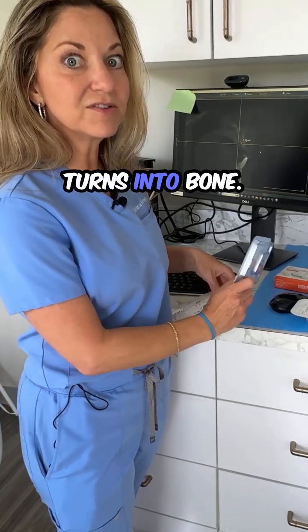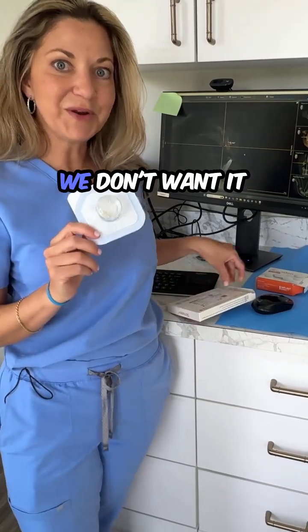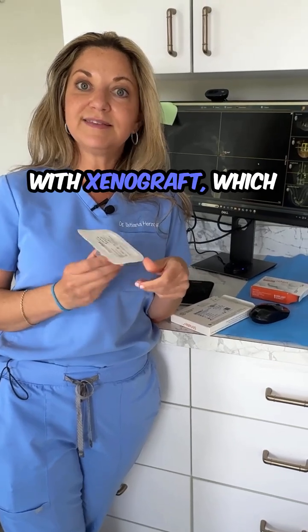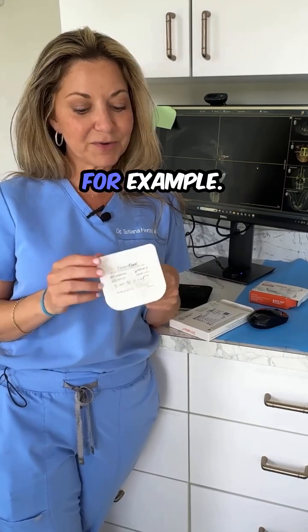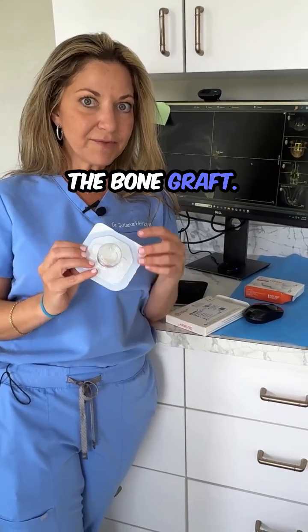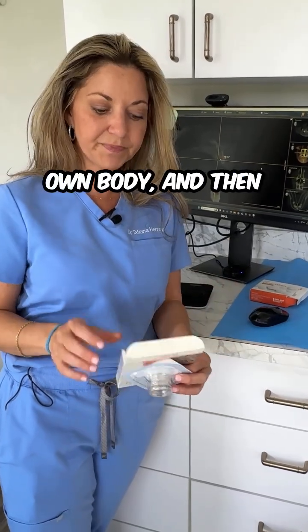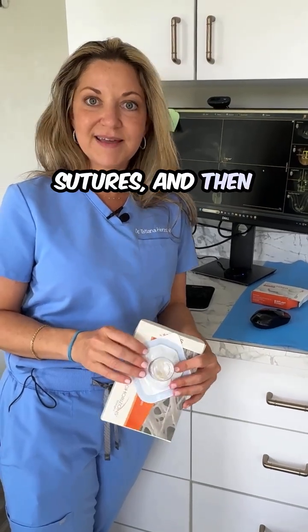But it then turns into bone. The bone graft material, on the other hand, we don't want it to dissolve. So sometimes we'll even mix it with xenograft, which means bone from another animal, such as a cow, for example. And that's a really great bone to use because it holds the space. So now we have the bone graft, we mix it with the PRF which is coming from your own body, and then the membrane. And over that goes the sutures, and then you're off and away.